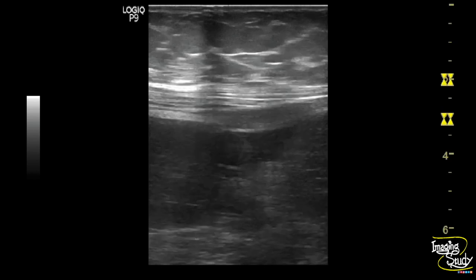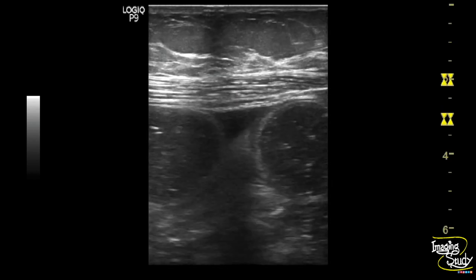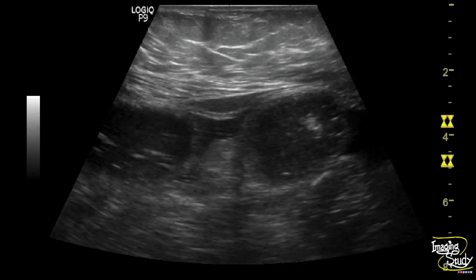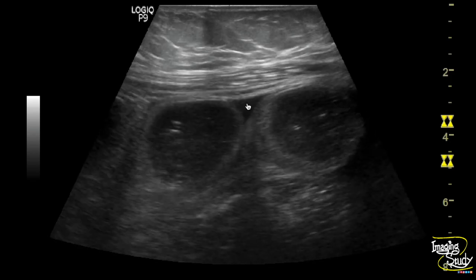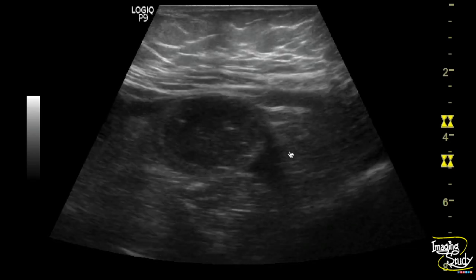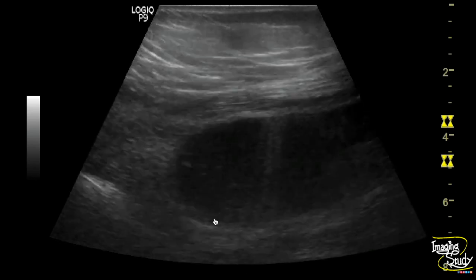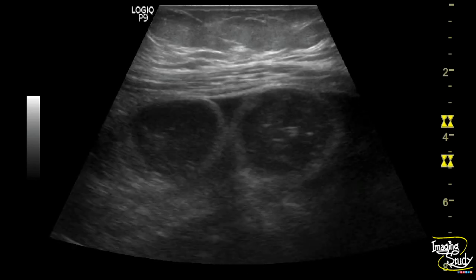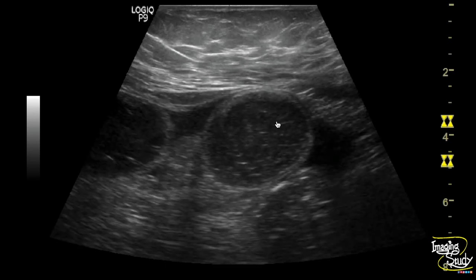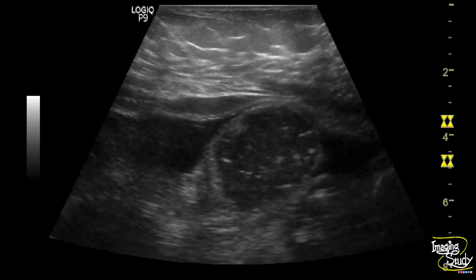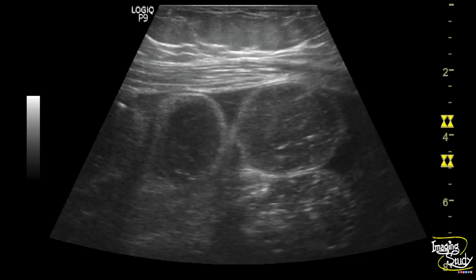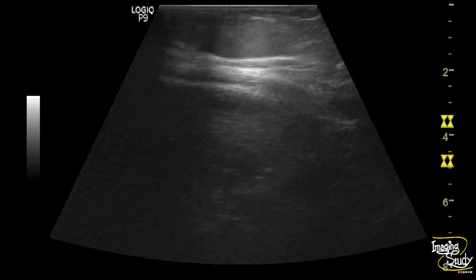Here you can see the high-frequency linear transducer view of the abdomen showing some fluid-filled distended bowel loops. You can see pointy triangular inter-loop free fluid forming the typical tanga sign. You can see some motion within these bowel loops — it is going forward and backward, forming the to-and-fro appearance. This feature suggests intestinal obstruction.